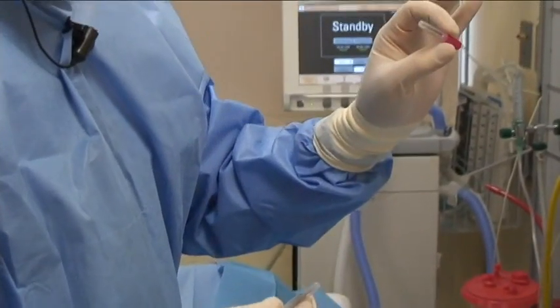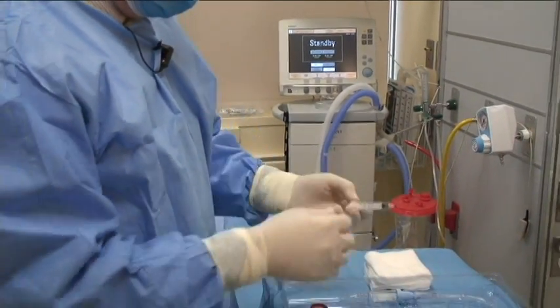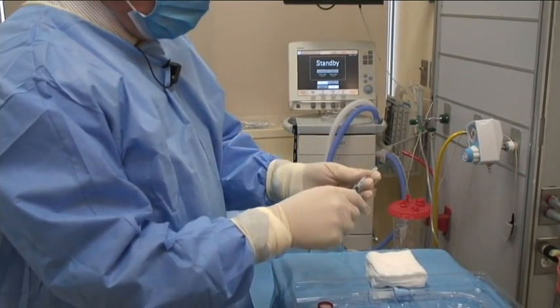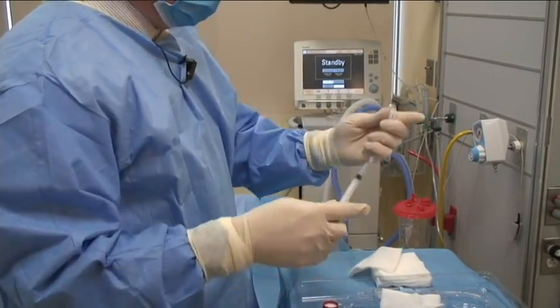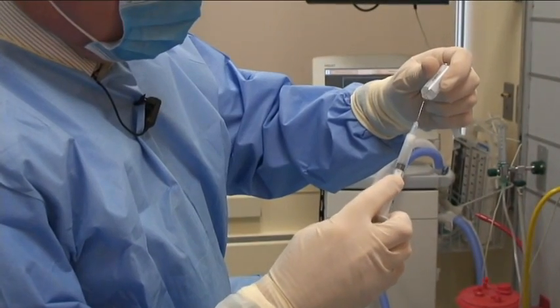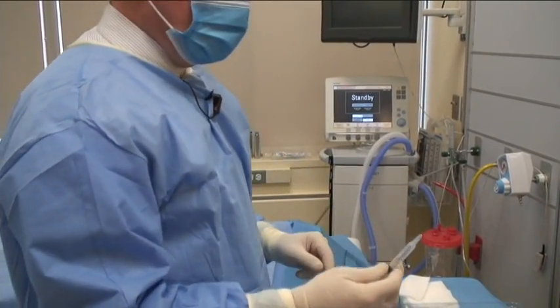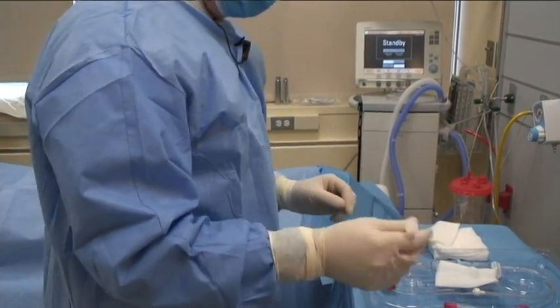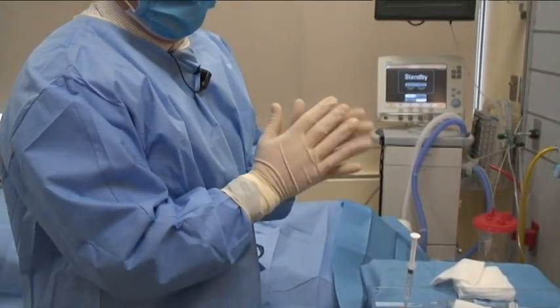It has a 25 gauge for numbing up the skin, and then we have a 22 gauge for going a little bit deeper. All right, and this is a small 3cc syringe. Now, we can actually draw up some lidocaine here for the procedure. As shown. And then, I'm using this one and the 25 gauge needle, I can proceed to anesthetize the area. This is a mannequin, so I'm not going to actually do that step. And it should be a standard set that you would do with any local procedure.